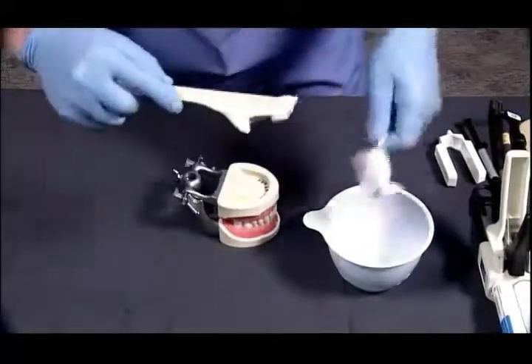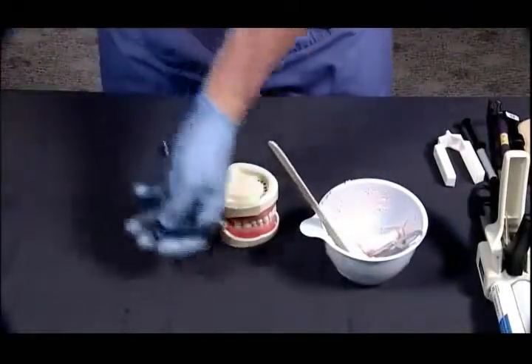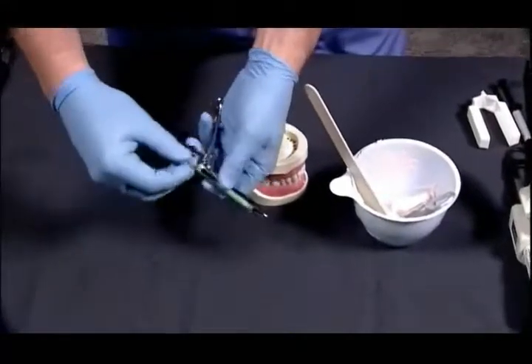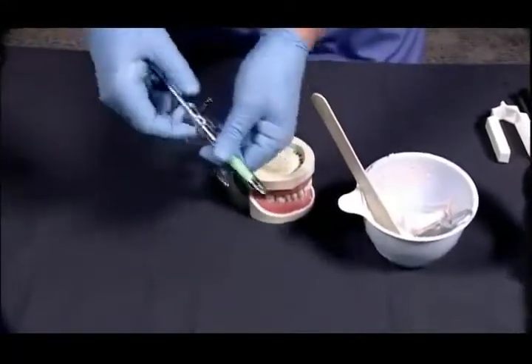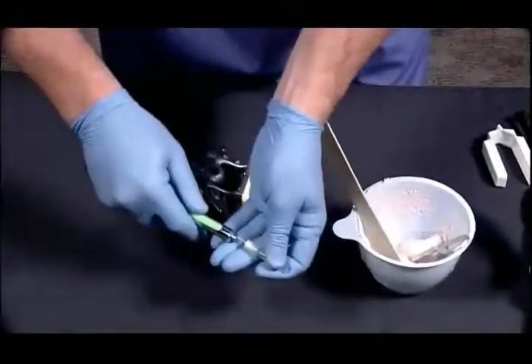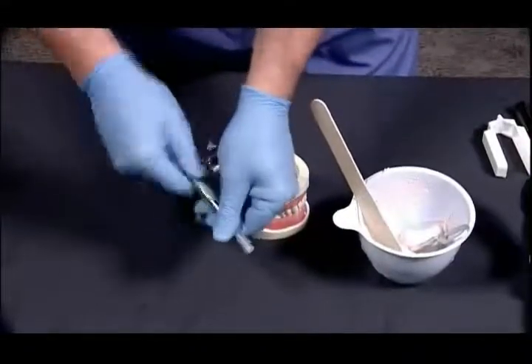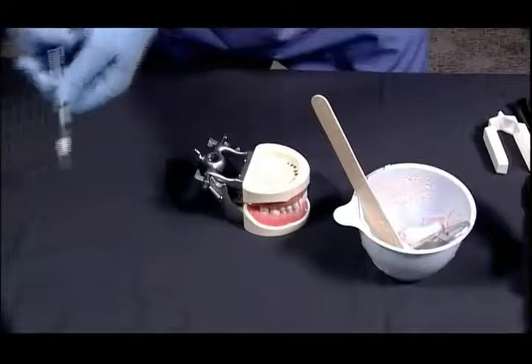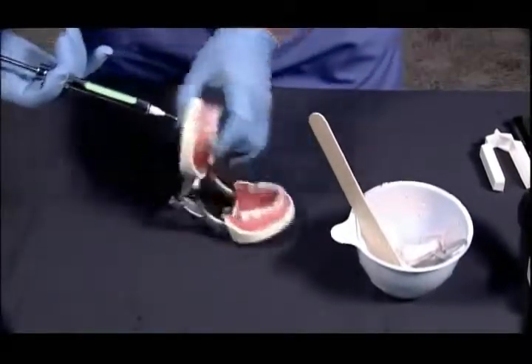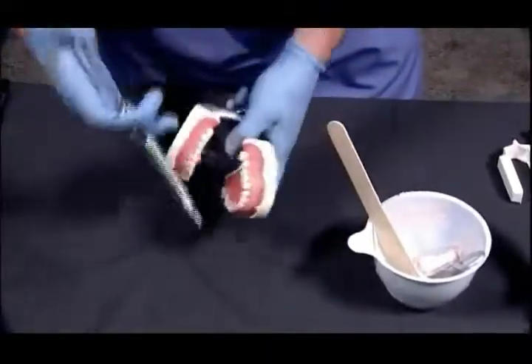I'm going to set this off to the side for a moment, and I'm going to load up our syringe, and this is how the hydrocolloid is delivered, in almost an anesthetic syringe type situation. On that syringe will be a blunt-ended tip. We'll make sure the tip is on generally before we get started with the impression. Take that off. We're going to take a little bit of excess out first, go to the model, and the patient's tooth number 3 we're going to be impressioning.